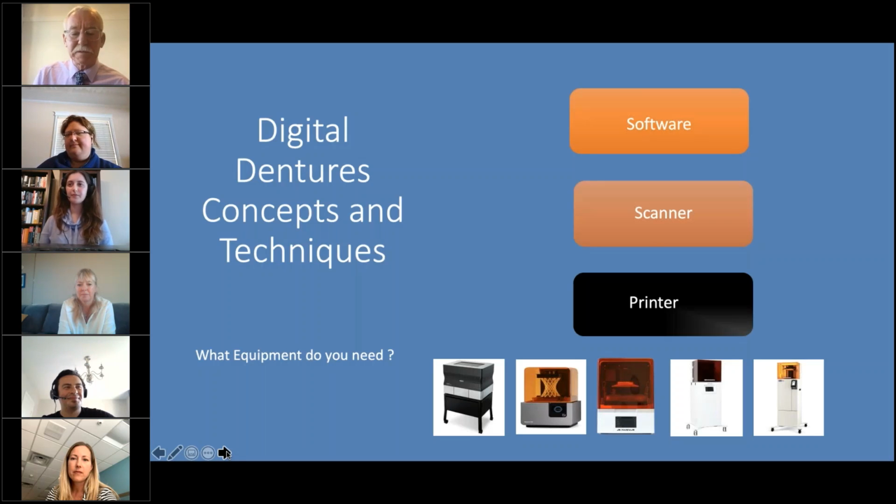The first printer I bought was the Objet printer, the Stratasys printer. That's about $70,000. Great workhorse. It's a Hummer, but it's expensive to run. Still going. Still going.